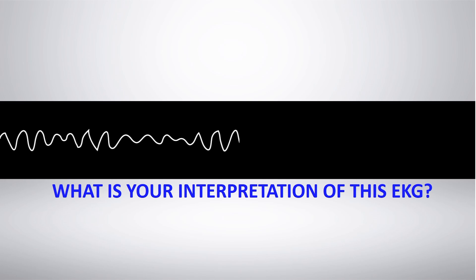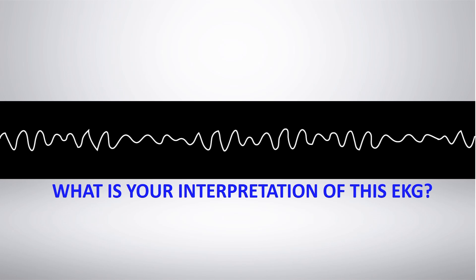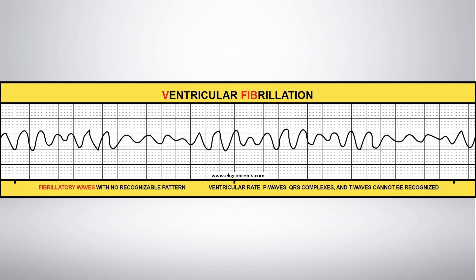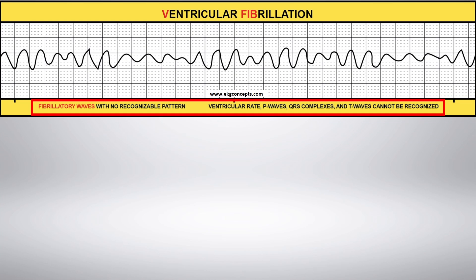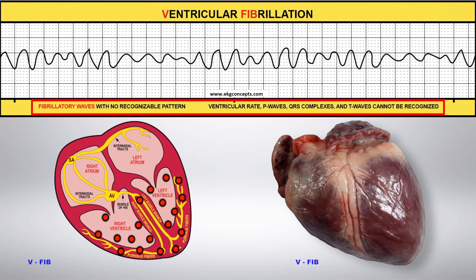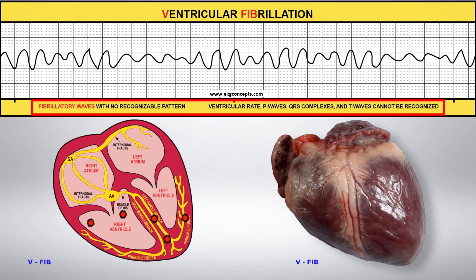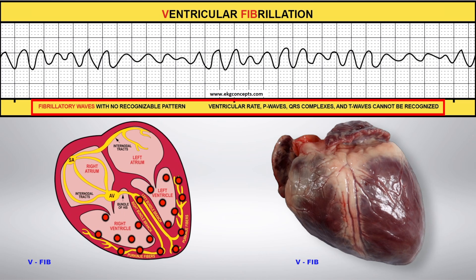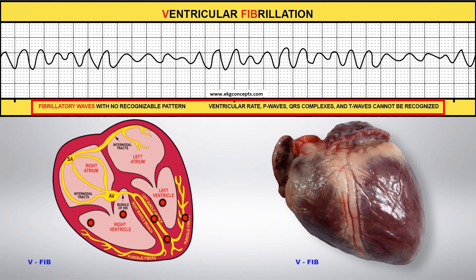What is your interpretation of this EKG? Ventricular fibrillation, more commonly known as V-fib. It is the most serious cardiac rhythm disorder. Just like atrial fibrillation, you have irregular and chaotic impulses, but now they are in the lower part of the heart, or the ventricles, which pump blood throughout the body.